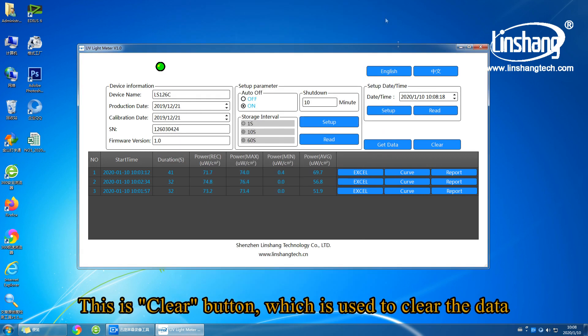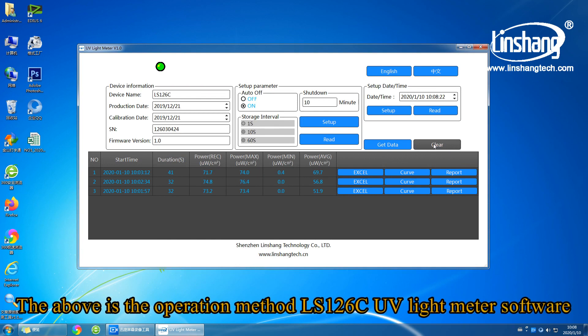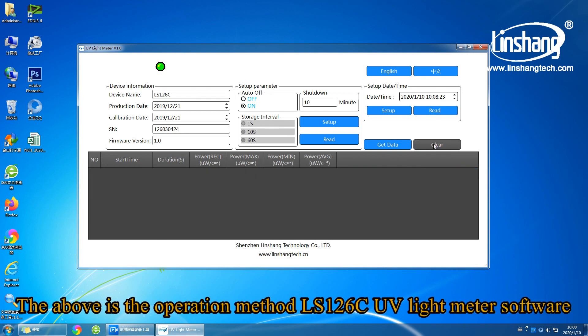This is the clear button, which is used to clear the data. The above is the operation method of the LS126C UV light meter software. Thank you.